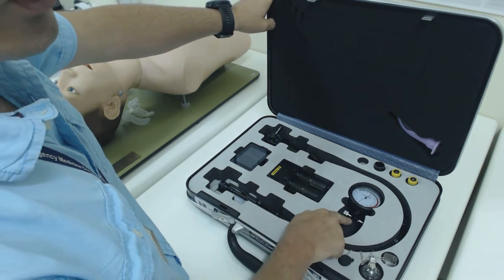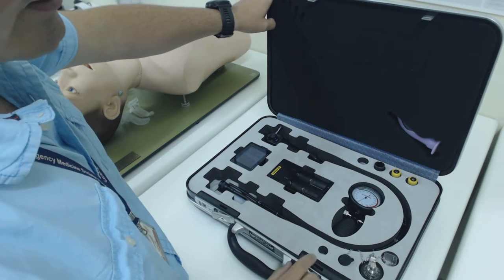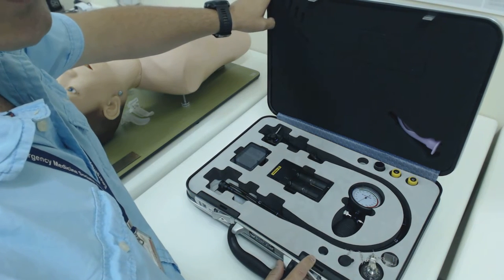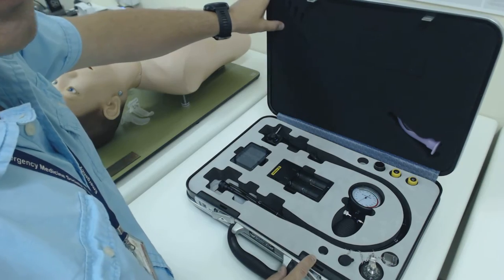You'll also notice that there's a pressure manometer and a seal which protects the scope during cleaning and allows us to do pressure tests before we operate it.